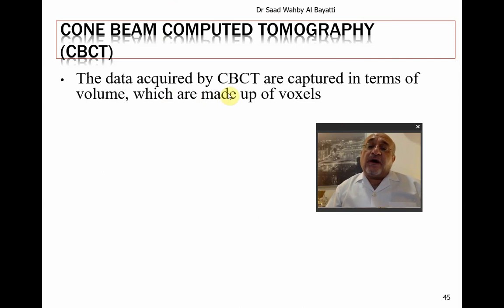The data which is acquired by the CBCT is captured in terms of volume, which is made up of voxels.